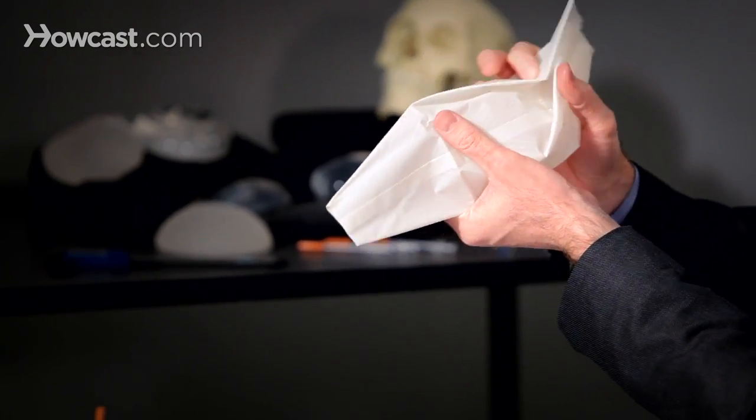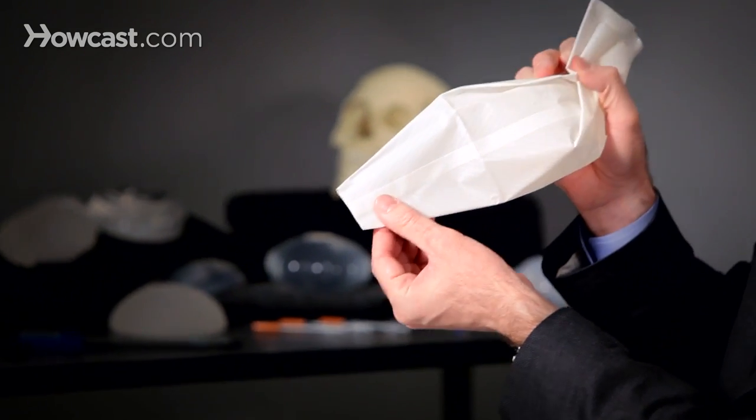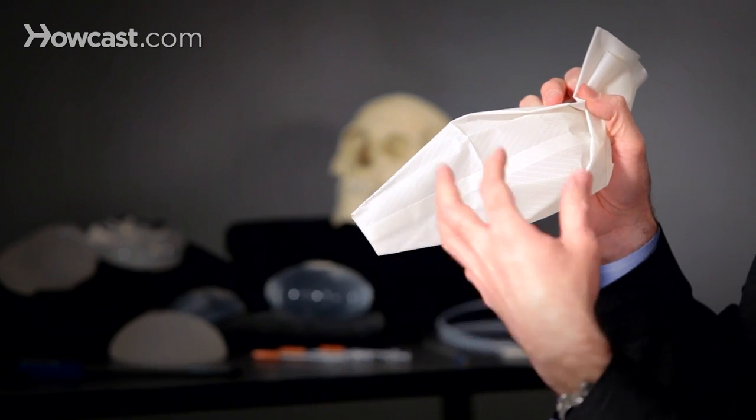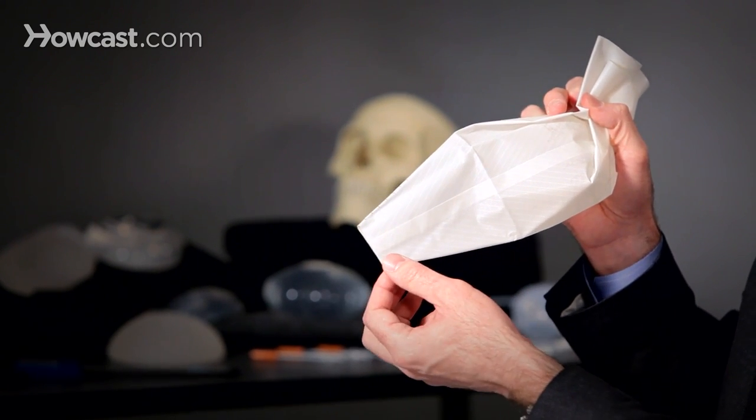The tip of the funnel device is then placed inside of the patient's breast cavity that has already been dissected in order to fit the breast implant.